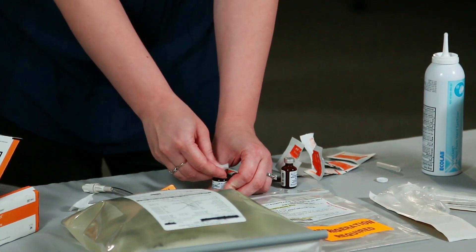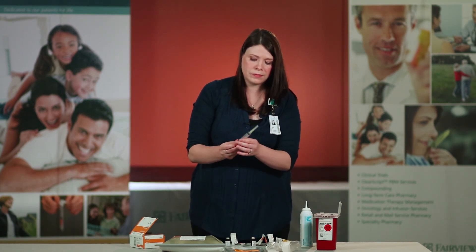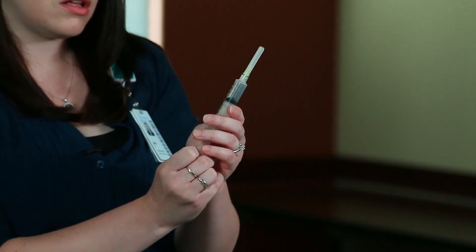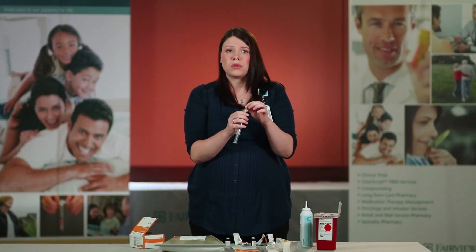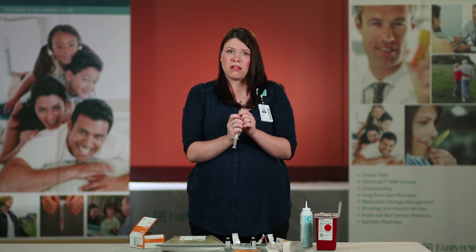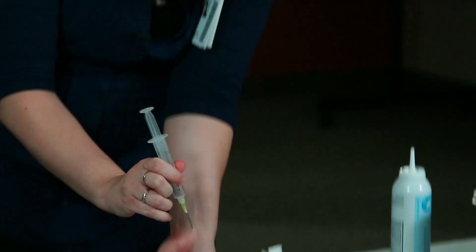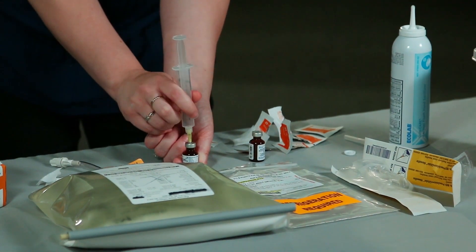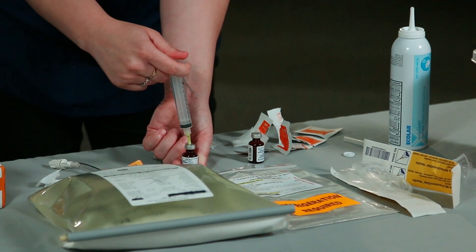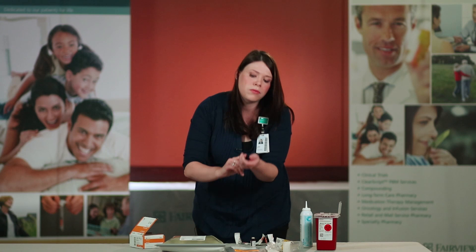Remove your second syringe from its package and draw up five milliliters of air. It's good to note that if you are doing the pediatric dose, you will need one milliliter of air for your small vial and four milliliters of air for your larger vial. Remove the cap to the needle, ensuring that you're not touching the tip of the needle. Put the needle directly in the center of the vial port, instill all of the air, and while holding pressure on the plunger, flip the vial upside down.